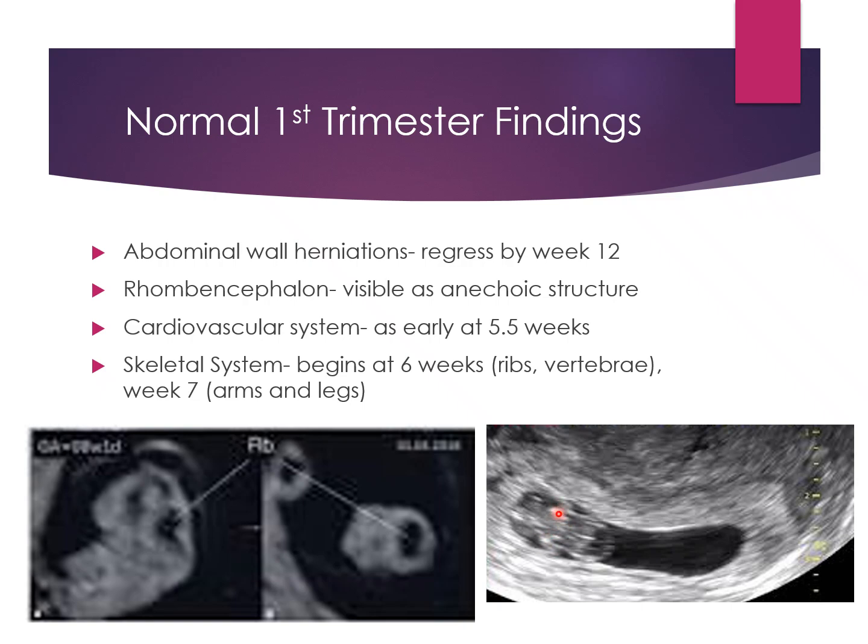And so somewhere around that half mark is where you're going to find the heart, and it's going to look like a little flutter. You should be able to see it. And you're going to record it with M mode. We do not use pulse wave Doppler on a first trimester pregnancy. Ever, ever, never. Okay? And then around 6 weeks, so this guy here, he is about 6 weeks old.